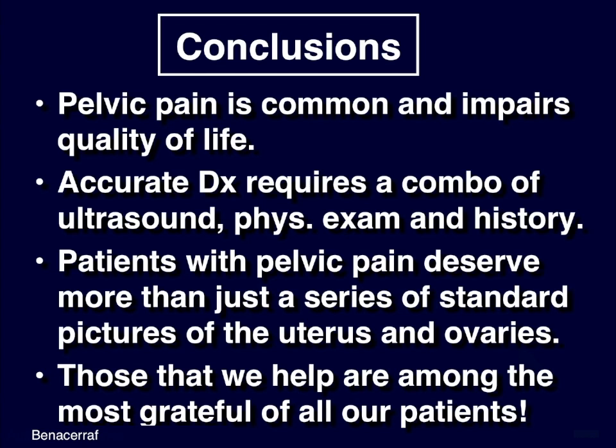Patients with pelvic pain deserve more than just a series of standard pictures. That is our protocol of the uterus and ovaries. Take it a step further. Find out where the patient is in pain and image it. Those that we help are among the most grateful of our patients.